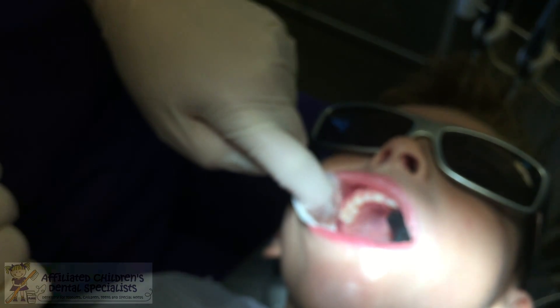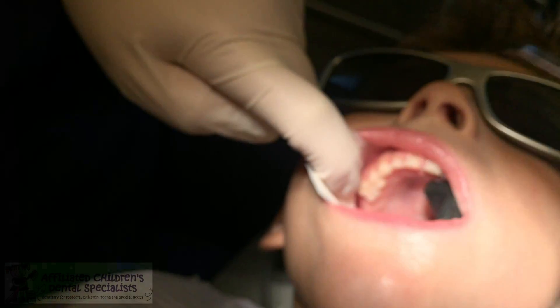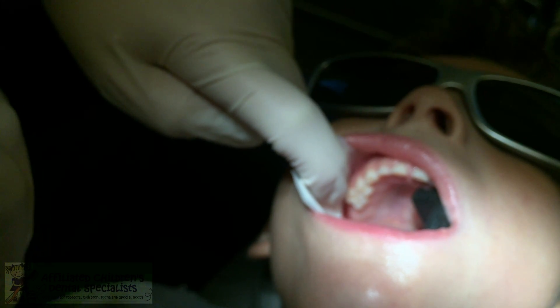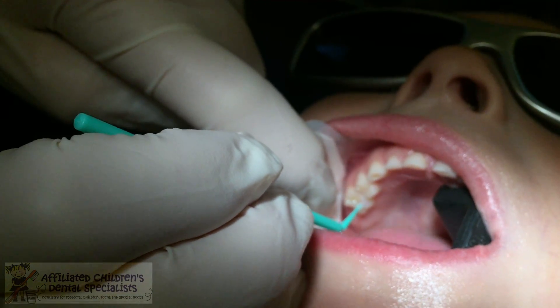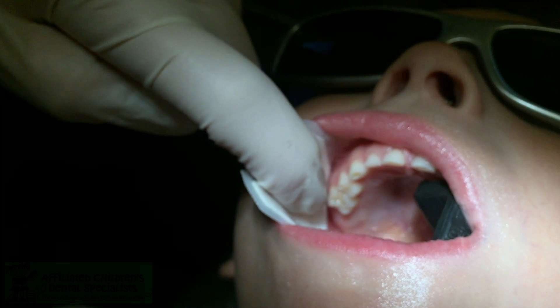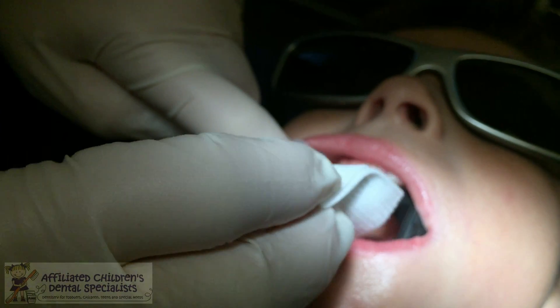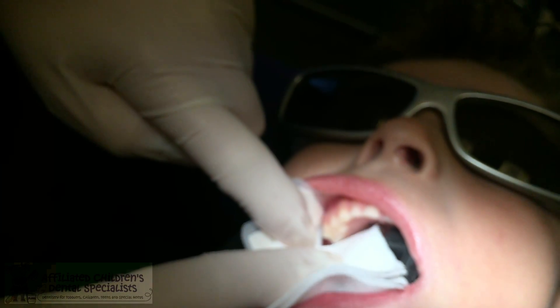We do want to dry it because now I'm going to apply the silver diamine fluoride. Usually you don't want to desiccate the tooth after the cavity conditioner is placed, but in this case I do want it dry because I'm going to be applying the silver diamine fluoride. So I'm going to paint that on there for one minute — this is the medicine going on your tooth, the SDF. We're going to set a timer for one minute, and then once the timer goes off I'll blot off any excess. I'm going to put this under your tongue just in case you decide to lick it.